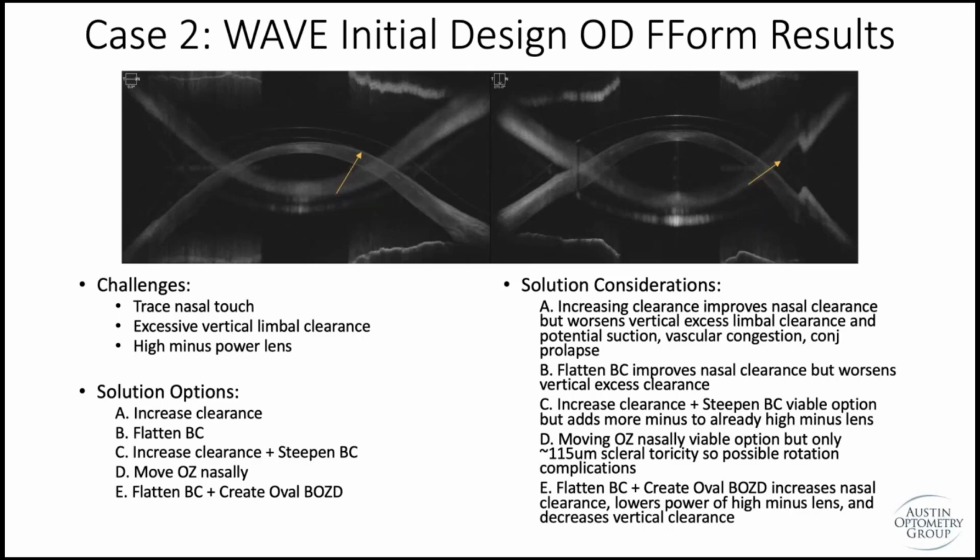In his particular case, if I move the optic zone a millimeter or two nasally, and then that lens wants to rotate, now I'm all over the place with my optics. All right, last option. This is what I went with.